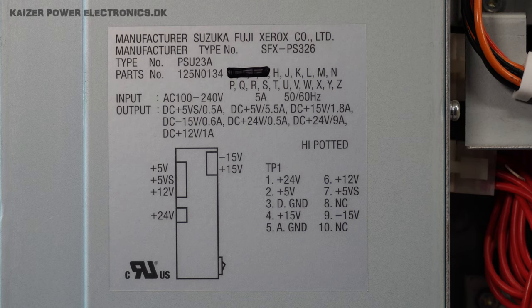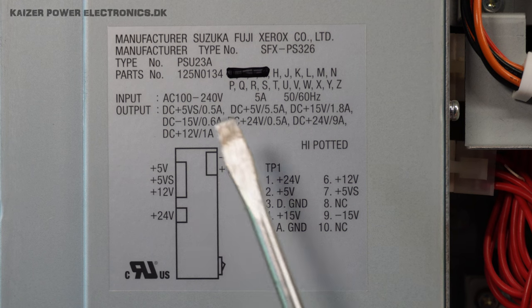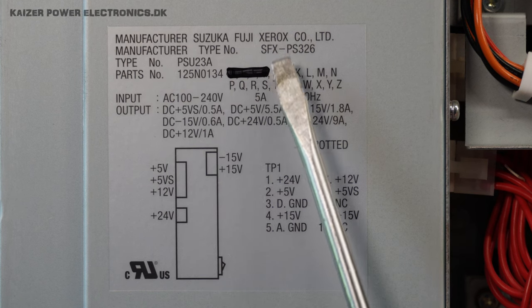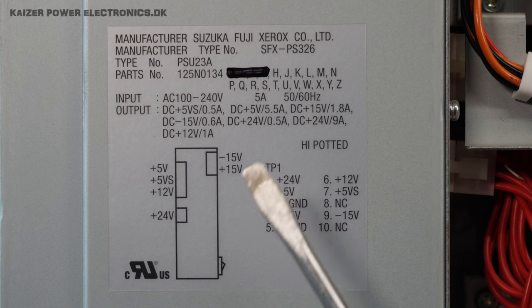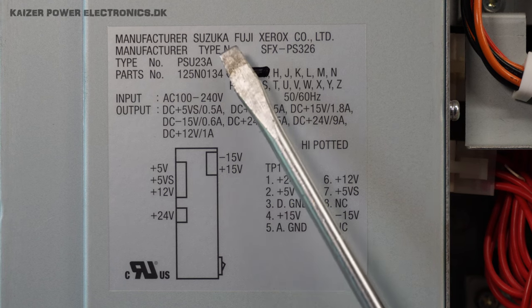There's a sticker worth noticing here on the side — it's a power supply layout, and the manufacturer is listed as Suzuka Fuji Xerox. So right now we have Fuji Xerox and Philips cooperating in making this unit. Seems like everything to do with printing is owned by the same few people.